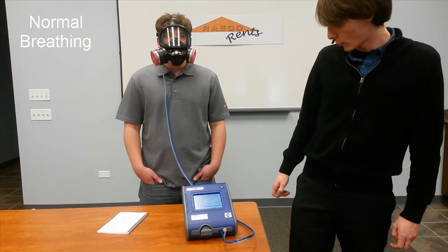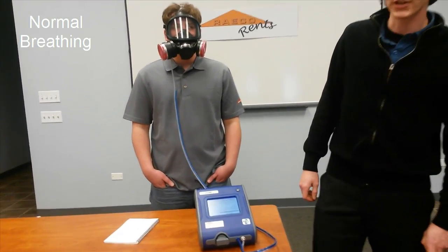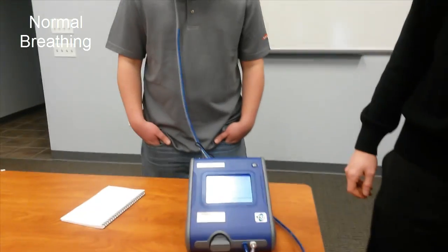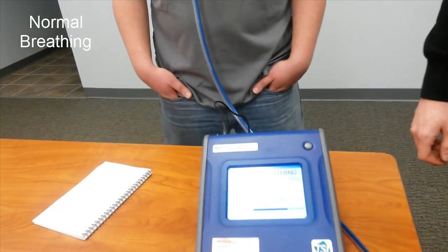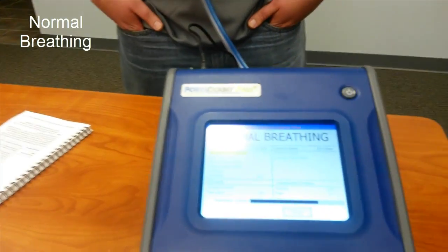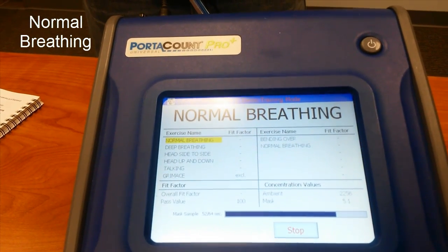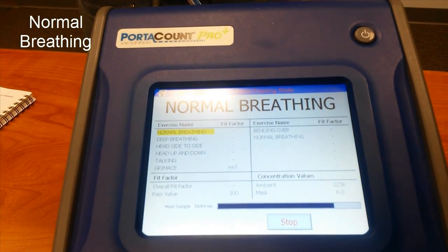Once it goes through the normal breathing portion, it's going to have you do deep breathing. Deep breathing is just going to be heavier breathing as if you're working heavily. You don't want to overdo it because that can change the results of your Fit Test.